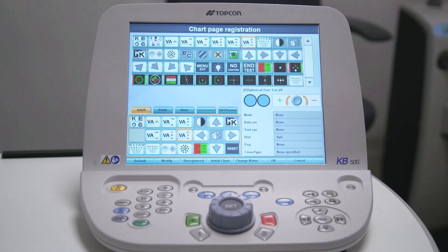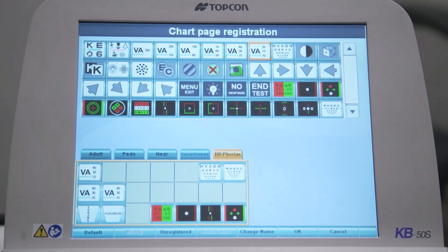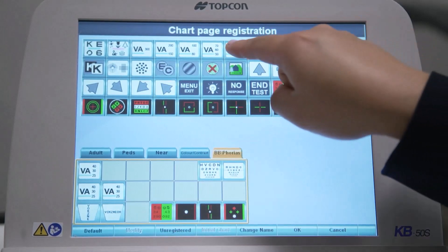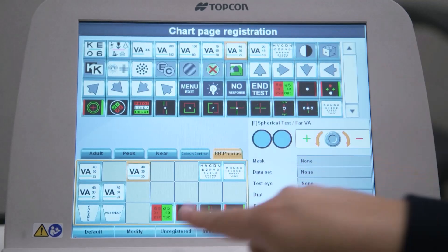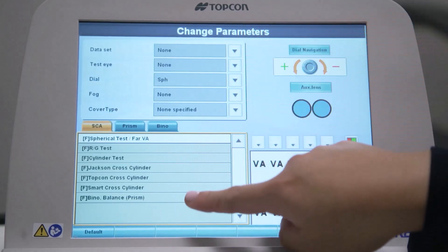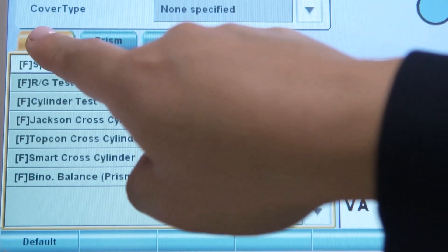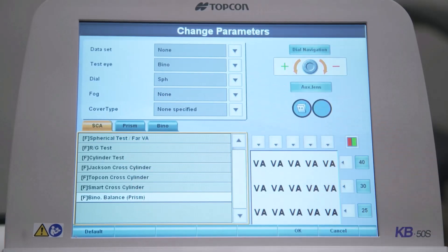The next stage is to customize the functions of the individual chart icons. Selecting a particular chart from the main screen changes the chart on the test chart and brings up auxiliary lenses associated with the function of that chart. You can modify a chart icon to change the type of refraction test that you are doing. To do this, select a chart icon under one of these tabs — let's use this visual acuity chart. Touch the Modify button at the bottom of the screen and the change parameter setting screen will appear. Tests found under the SCA (sphere cylinder axis), the prism, or the binocular tab can be assigned to this chart icon. For our example, I will assign binocular balance with prism to this chart. I simply select this option to add this test feature to the chart.